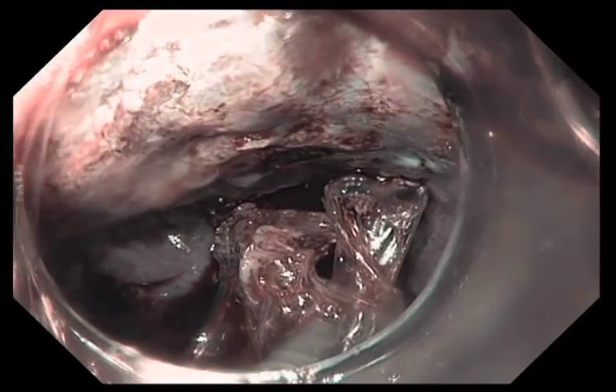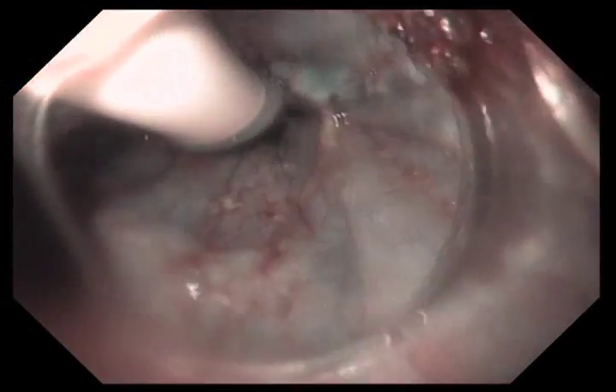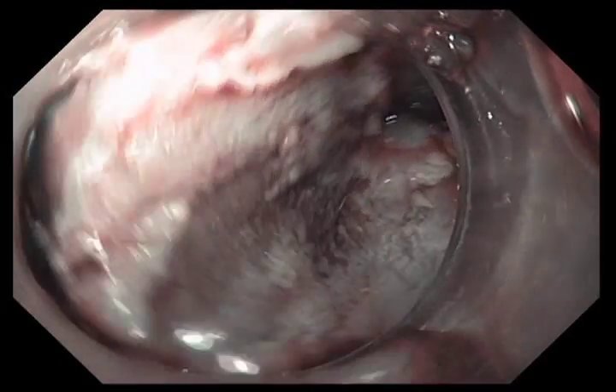There in the distance you can see the untreated Barrett's. We've now advanced the balloon. I've sucked out the air. We're inflating the balloon, and when the machine tells me the balloon is inflated, I'll hit the treatment pedal — about one to one and a half seconds. The treatment is delivered, the balloon is deflated, and now we're going to look and inspect the area that we've necrosed.